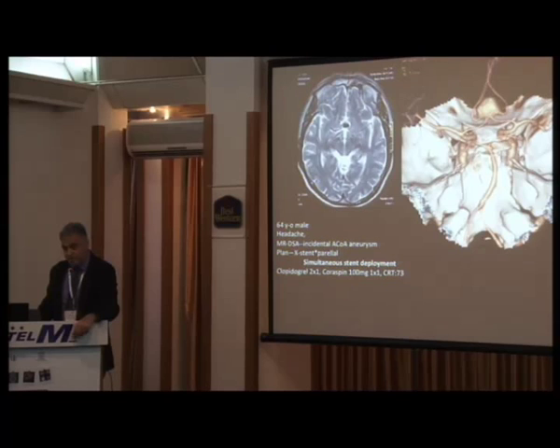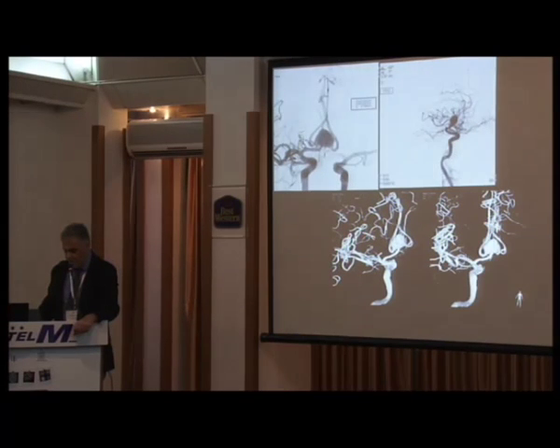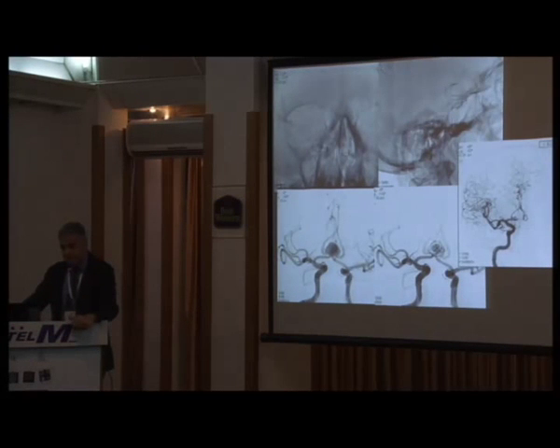How can you treat this one? The surgeons started to send that type of aneurysm to us. It's an ACOM, practically no neck, and no surgeon wants to treat this one because of the problems of the reconstruction and the perforating arteries in that region. Look at that. I did this case in the live case course, with the two bilateral approach, stenting and coiling.